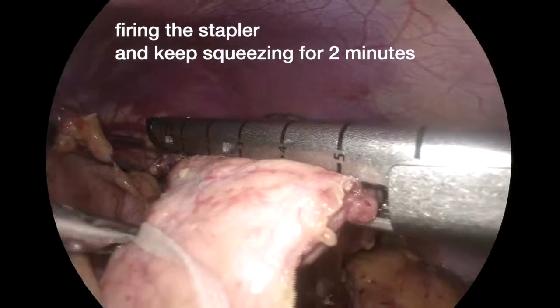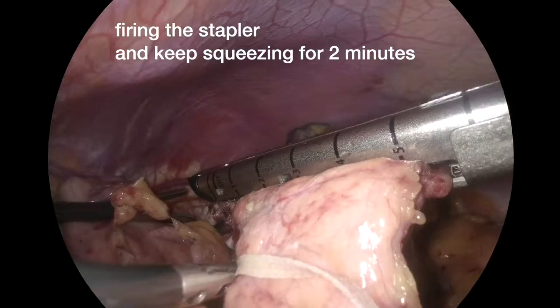After firing the stapler, we continued squeezing the parenchyma for 2 minutes before releasing the trigger.